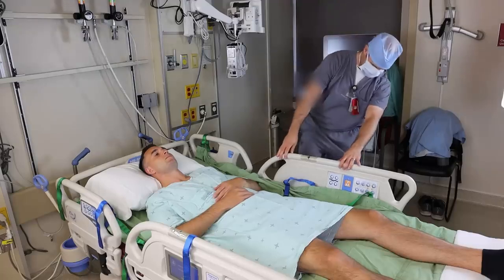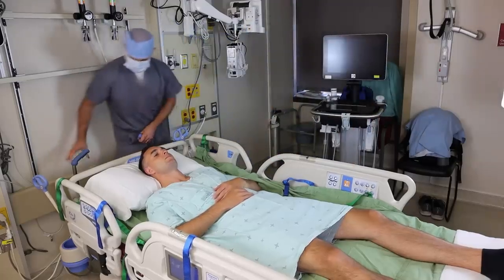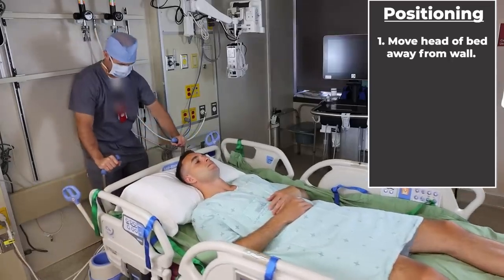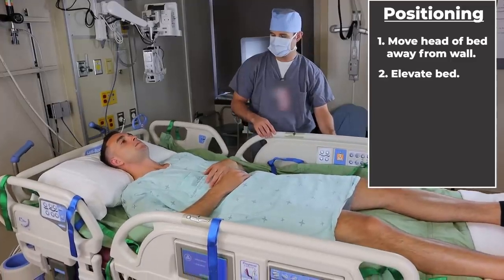A smooth central line is all about preparation, and Dr. Parsons is helping me out by attending to patient positioning. So first, he unlocks the bed and moves it so that there is ample room at the head to stand. Next, he elevates the bed to a comfortable working height for me. Thanks, Mike. That's good.